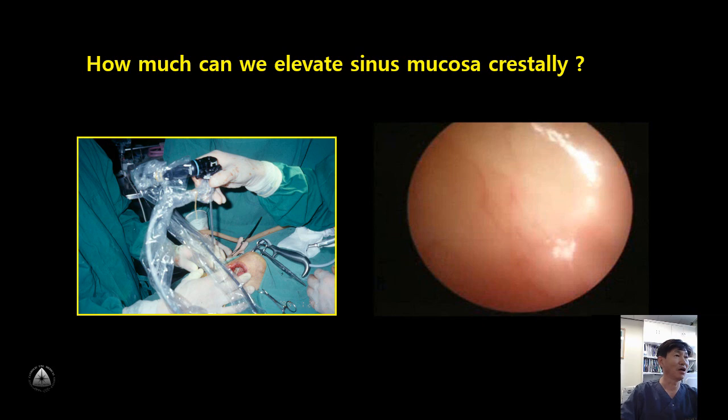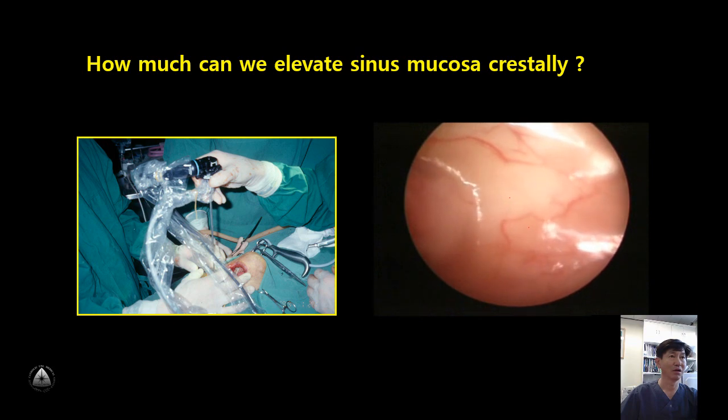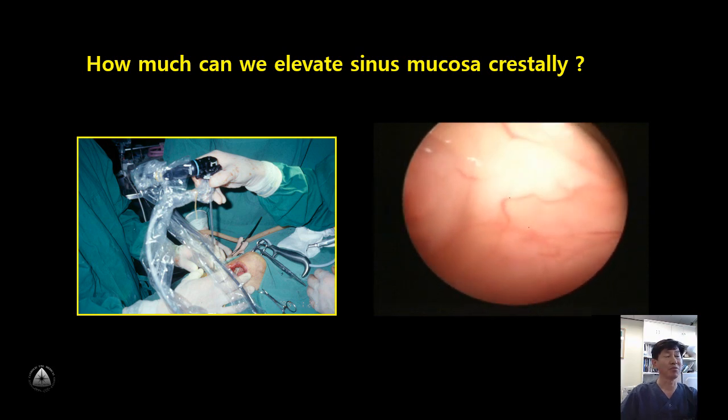I used ENT endoscopy in order to figure out how much I can elevate the sinus mucosa during the osteotome technique. You can see mucosa elevation during the osteotome technique, and a tiny mucosal perforation around this area after achieving 5 mm of mucosa elevation.